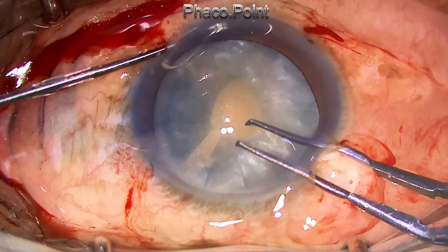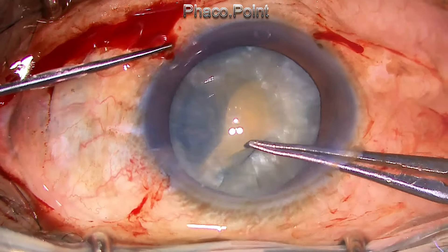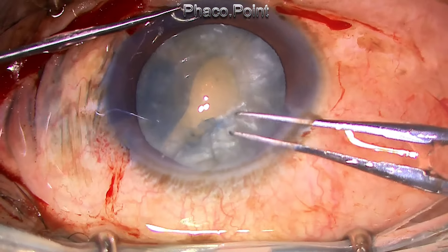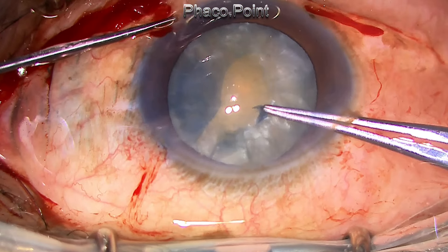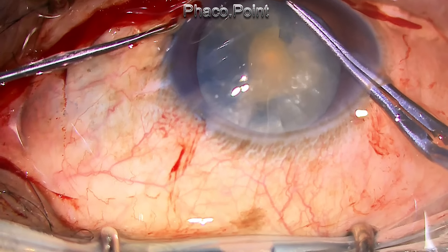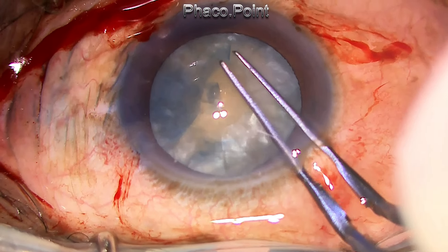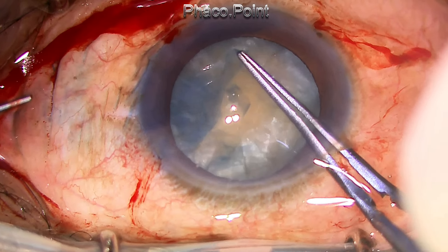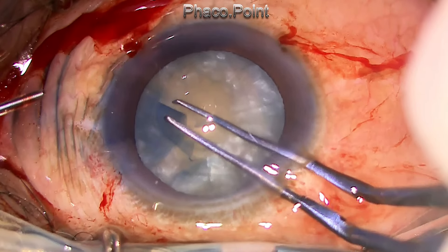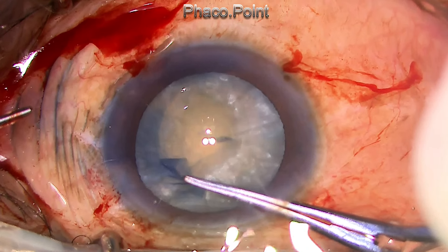While attempting the capsular rhexis from that point again, I find that I have not created a break. So I create a small opening using the Utrata forceps itself, and then I am able to control the rhexis size to a very desired 5mm. You don't want too large a capsular rhexis, because you want sufficient anterior capsule to be left behind to place a sulcus-based intraocular lens if need be. In this case, I was able to round off the rest of the capsular rhexis — there was a single runaway point.